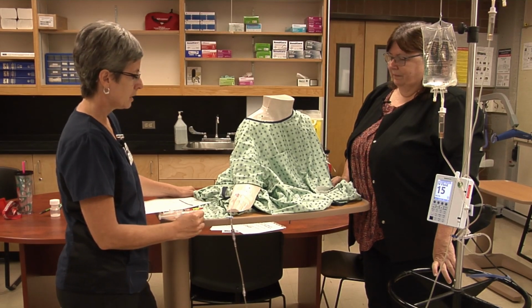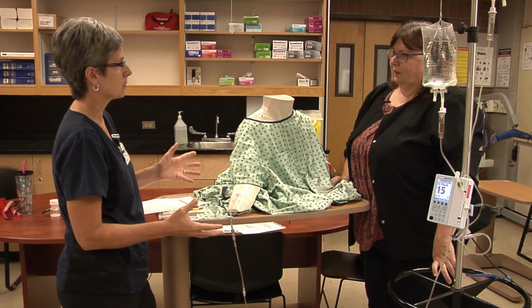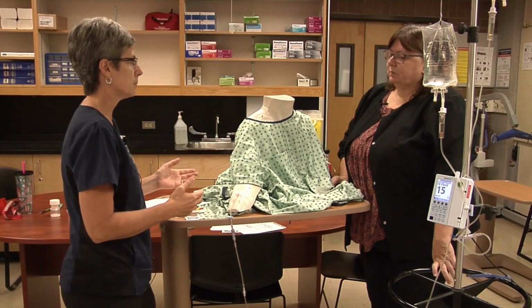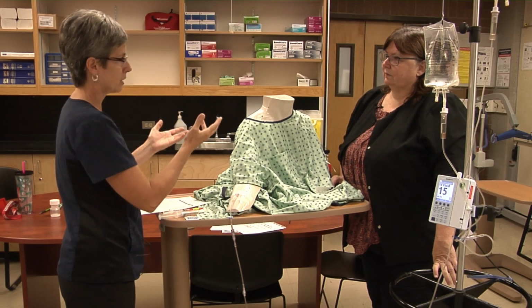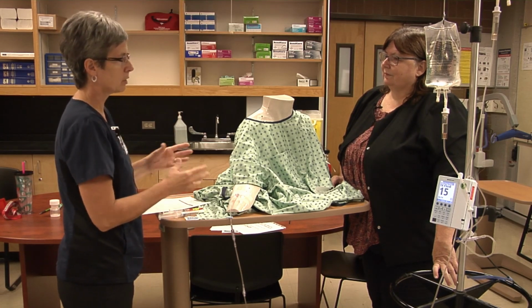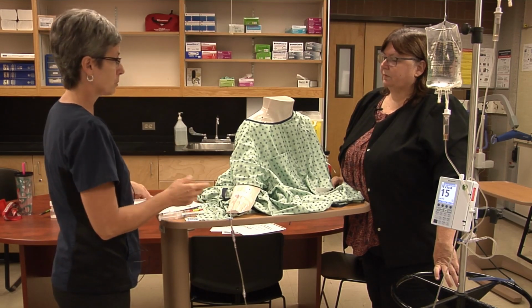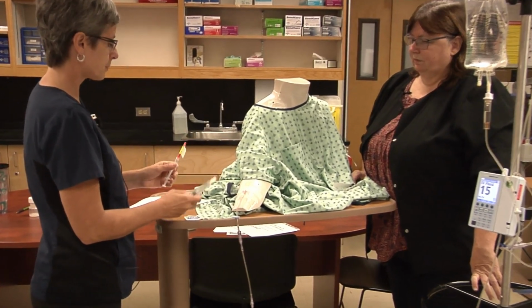Okay, so of course you've done your assessment, you've made your decision about which drug to give, what dose, route, patient, time, all that stuff. Your hand hygiene's part of it, you go to your medication dispensing system, you take it all out according to your policy, and then you prepare it with all those principles that we've talked about before. So I have my medication ready.